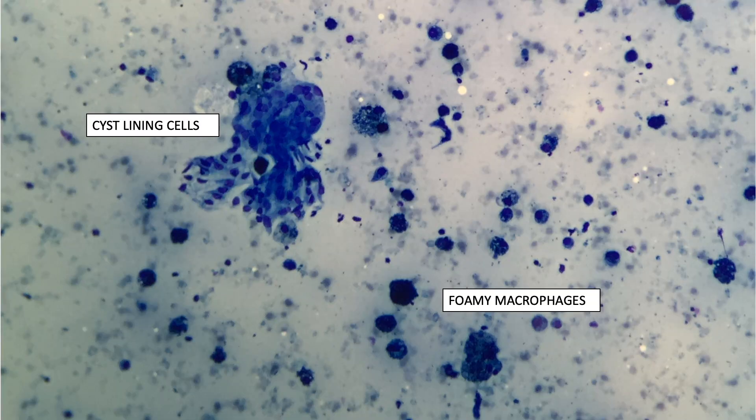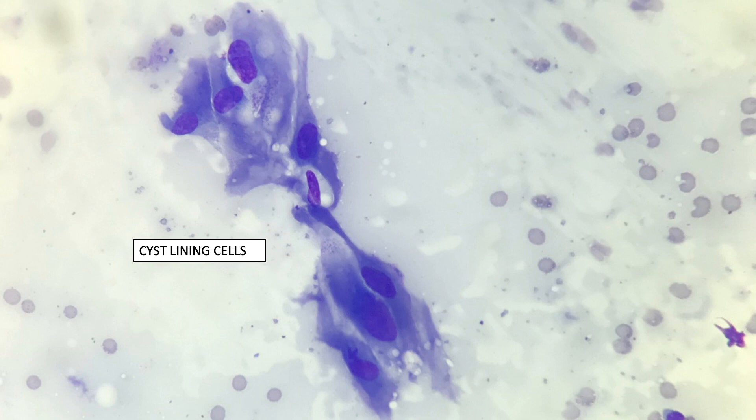When the sample has extensive cystic degeneration, we can see some cyst lining cells, and these cells may often exhibit some degree of atypia. However, the vacuolated cytoplasm and the spindle cell format of the cell, along with the cystic background, is usually enough to regard those changes as reactive in the setting of a cystic component of a colloid nodule.